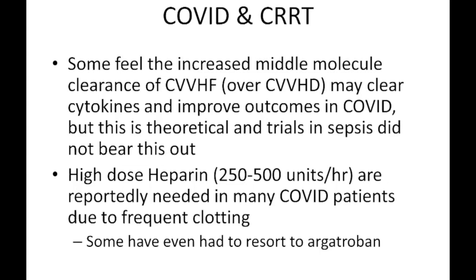There have been cases where patients are refractory to heparin, and there are doses that people feel are somewhat risky, and or if the machine simply continues to clot and break down despite the best efforts of heparin, then others have advocated moving to argatroban.